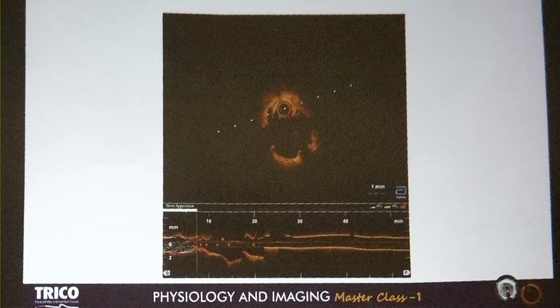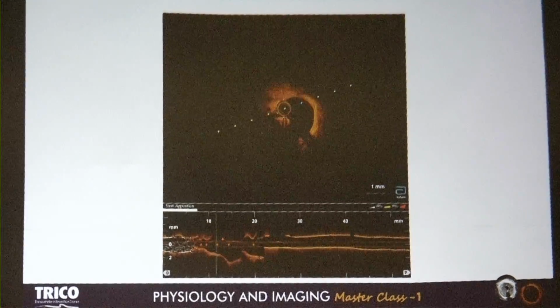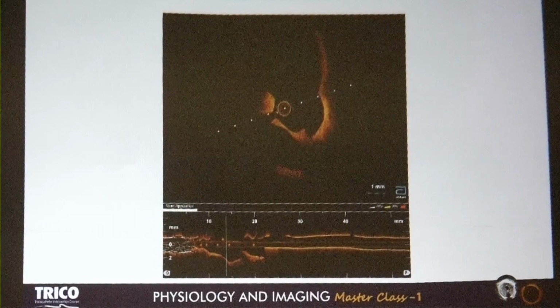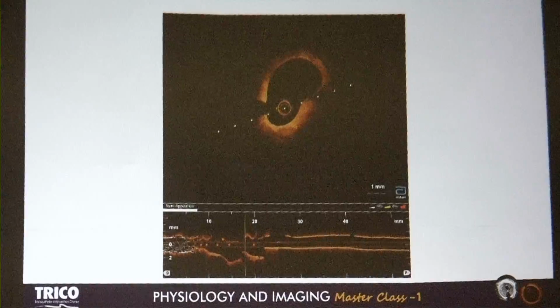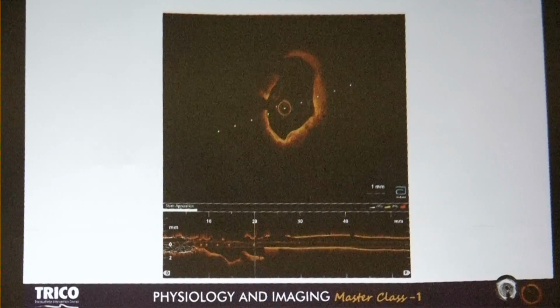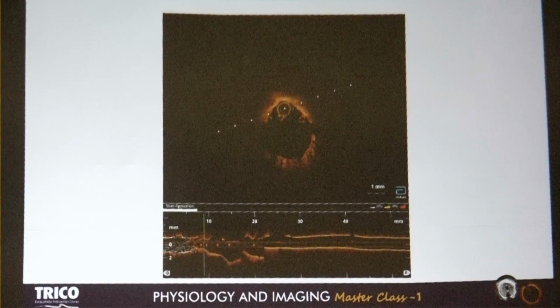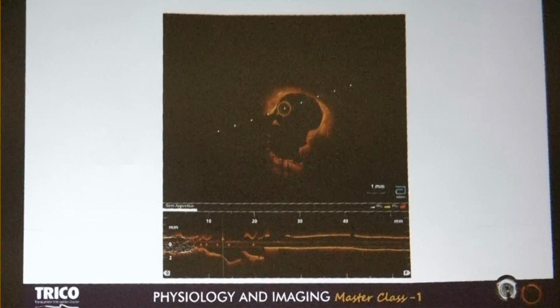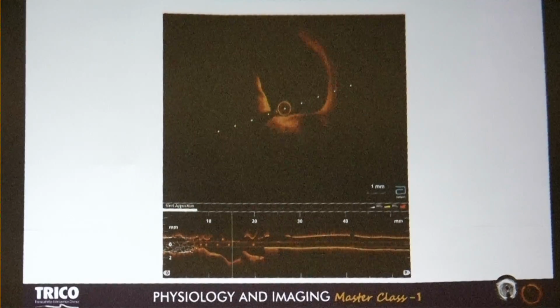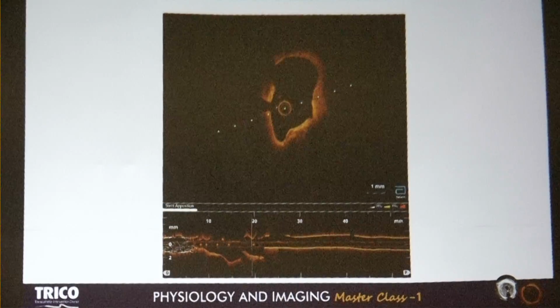Now just focus on the catheter lumen, catheter area, and see what you see. We had a very unpleasant surprise to see this. Are you guys able to make out what is going on? So right about there, it starts becoming aneurysmal, right? Yeah. Right there. And then you see right there is that shelf area.